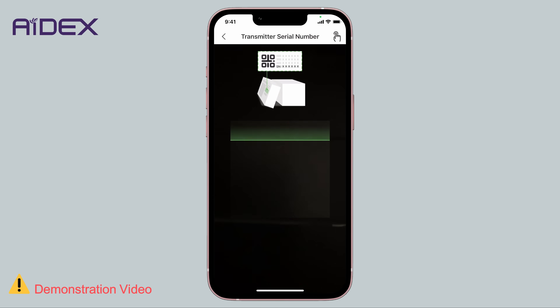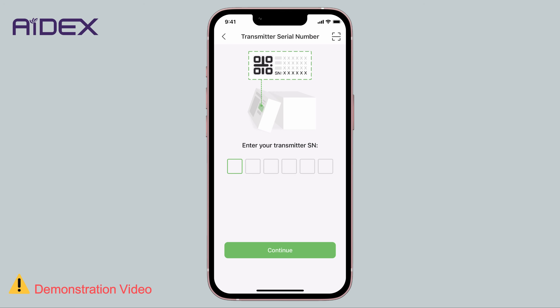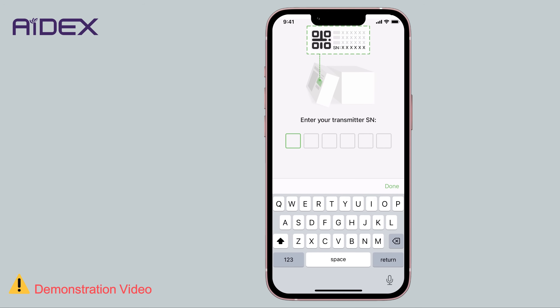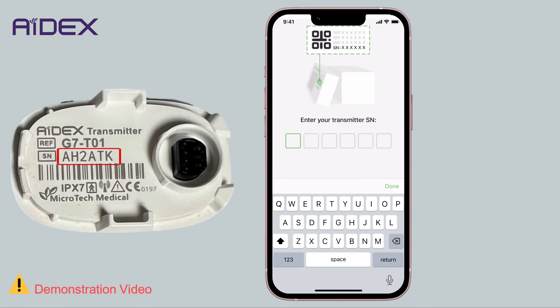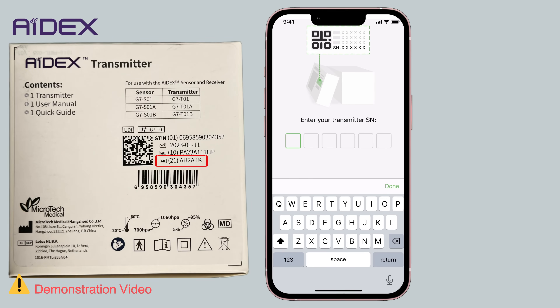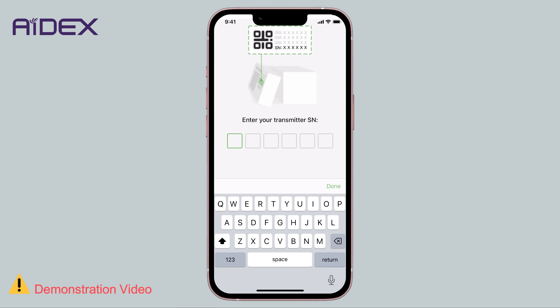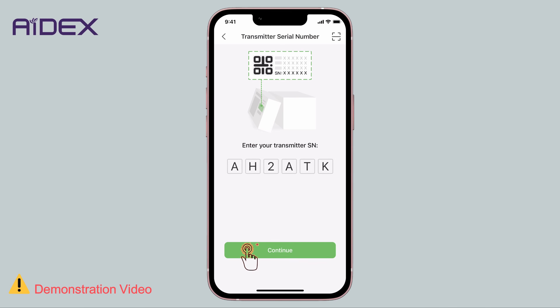If you're not sure how to use this method, tap on the symbol at the top of the screen to return to the previous page. Then enter the serial number for the transmitter manually. You will find the serial number printed on the transmitter itself, and it could also be found in the transmitter's packaging. Please note that the letter O is not used in the code to avoid confusion — it's always the number 0. Enter the transmitter's serial number and press Continue.